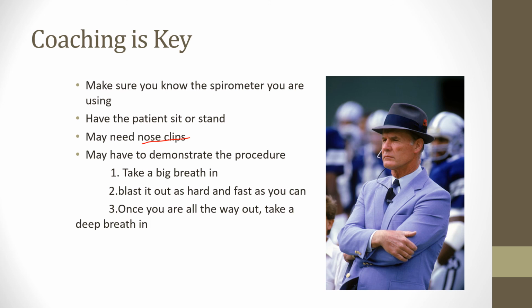You may have to demonstrate the procedure in front of the patient, and that's what I would always do. I always had my own spirometer mouthpiece in my locker at work, and so I would take it out if I knew I was going to do that test and say, okay, you're going to take a deep breath in through this mouthpiece, as deep as you can, and then you're going to blow out really hard. I'm not using the machine, but I'm just showing them with the mouthpiece how they're going to put it in their mouth. Some of the mouthpieces, they have to bite on it. Some of them, they put it inside their mouth and seal their lips. So there are going to be different types of mouthpiece out there, but you might have to demonstrate it, and that might actually help the patient understand the procedure a little bit better.